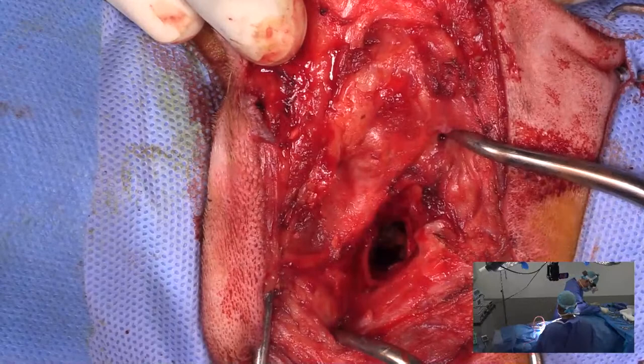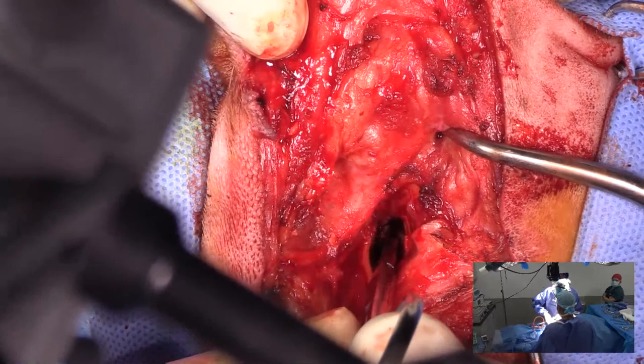So I'm just going to come over to my hemostats and just start pulling out secretory epithelium. This is awesome. Look at that. Nice big chunk all at one time.